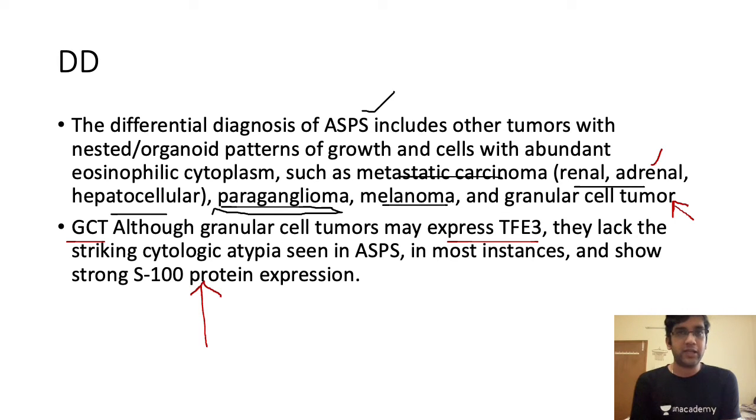Hopefully in future, if it comes in exam, great for you. I'm just going to leave this with an open-ended statement. There is a normal stain which I can do for alveolar soft part sarcoma. I wanted to comment on that. The granularity can be picked up with a normal stain, not an IHC. Please do comment on that, and let's see more cases in future.